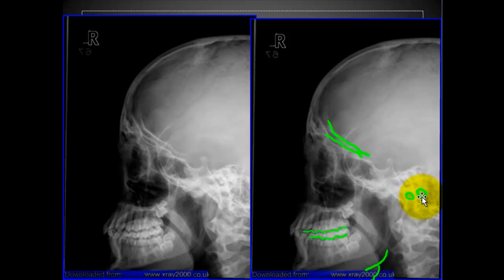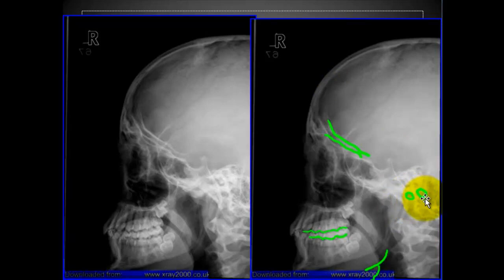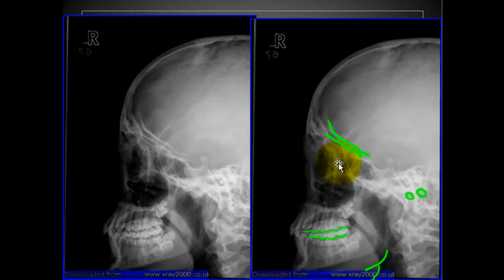The larger EAM is posterior — so if it's a right lateral, the smaller one is the right side and the larger one is the left. If the left is posterior, the patient's head is rotated a little to the left. So if you just turn this nose towards the image receptor a little more, it should bring this right into alignment.